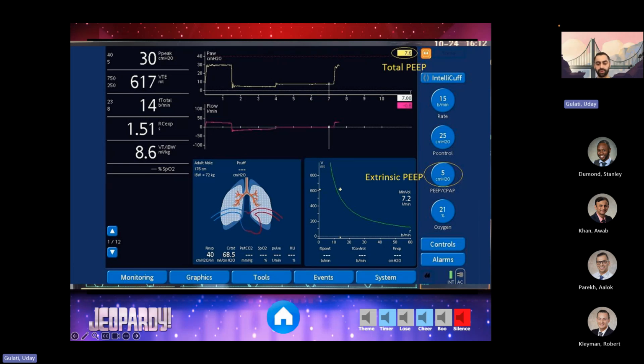One of the more complicated maneuvers that I'm sure we've gone over in the past is basically increasing the PEEP, provided you have good evidence to do this, and that allows you to overcome the intrinsic PEEP to allow that air to be exhaled. Solid job, man.